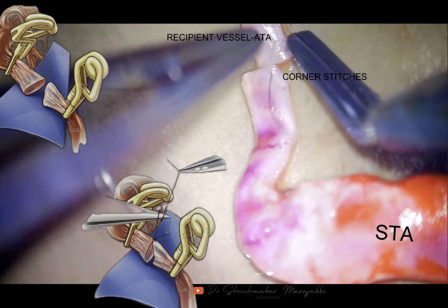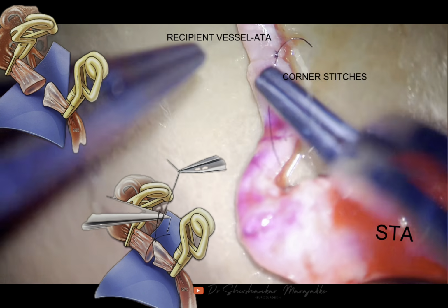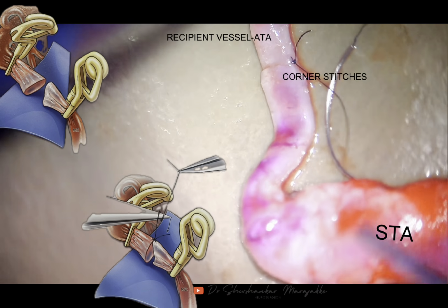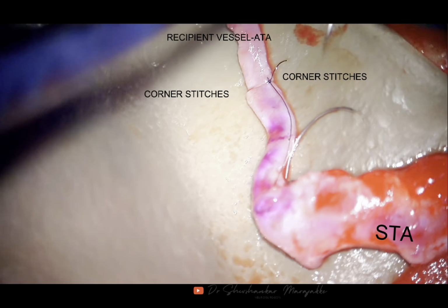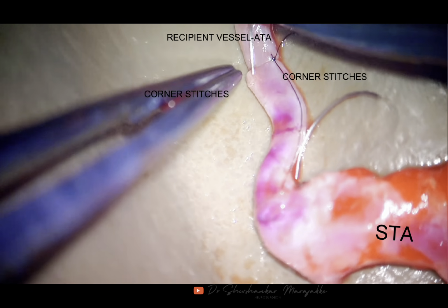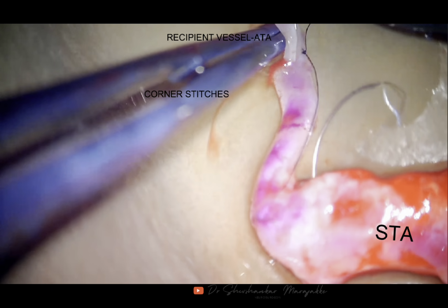The arteries must be rotated back and forth to see the two suture lines, and the walls must be shifted and aligned with microforceps for each bite. You can see here. These ongoing tweaks make the end-to-end anastomosis bypass require more surgical finesse than the other two.